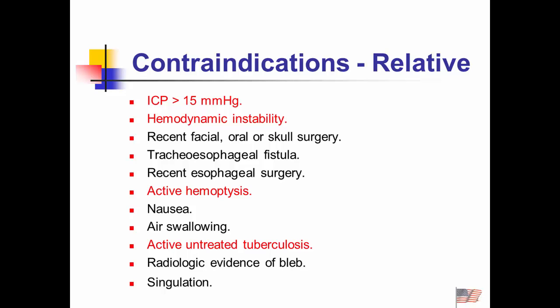Somebody who has active hemoptysis, and somebody that has untreated active TB, because again, we're aerosolizing perhaps those secretions that they're going to cough during a treatment, and it may be problematic. You can see there are some other ones there as far as nausea and air swallowing. Patients with blebs, because we don't want to create a pneumothorax in the process.